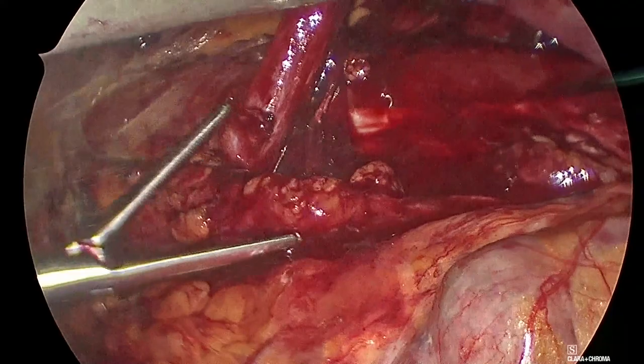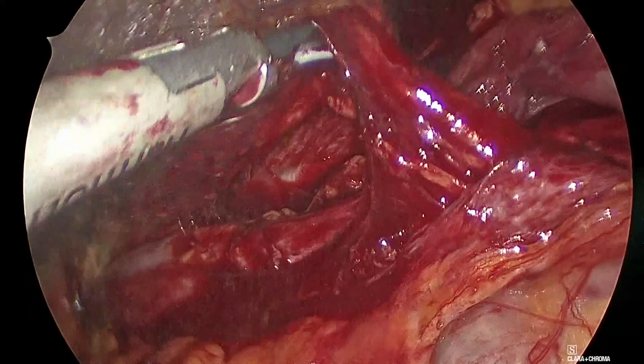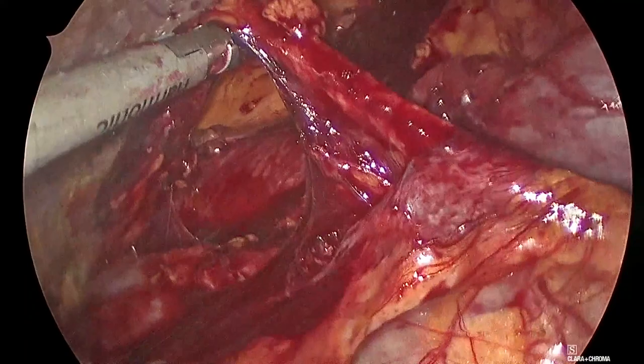Give me 2 Hemolock, small, big ones. So there's a little bit of a bleeder of the gonadal vein, so I will take.